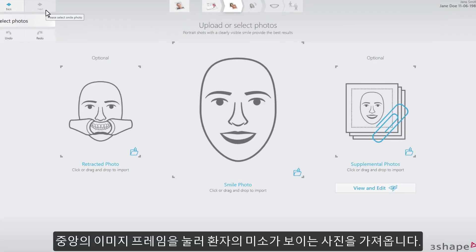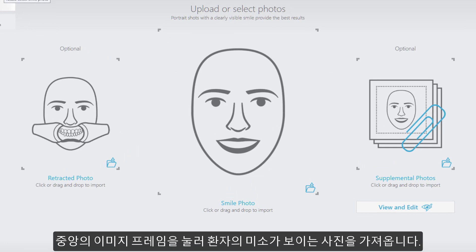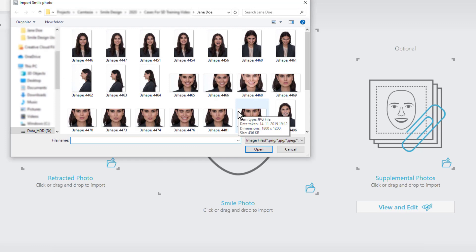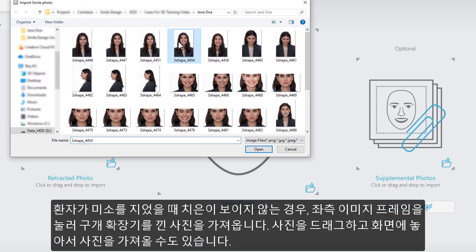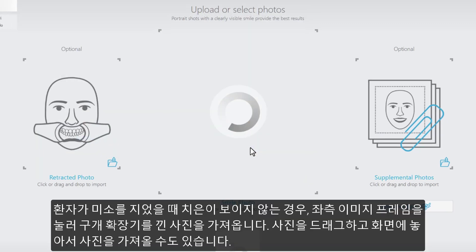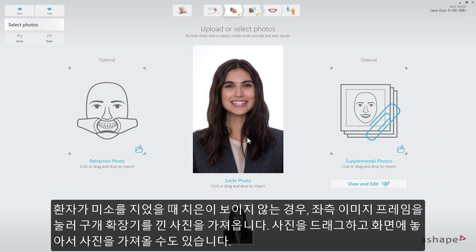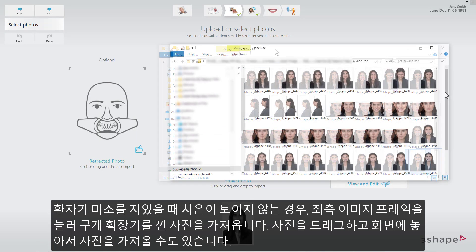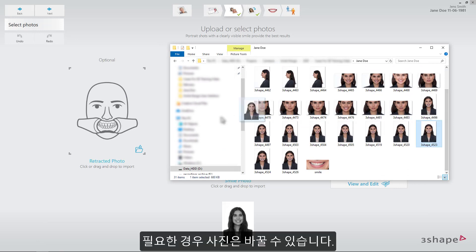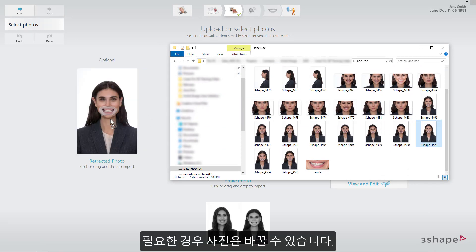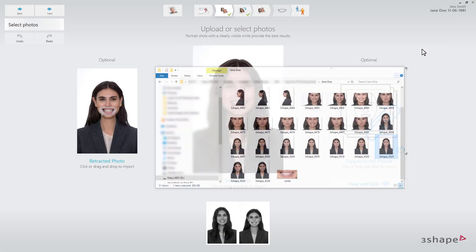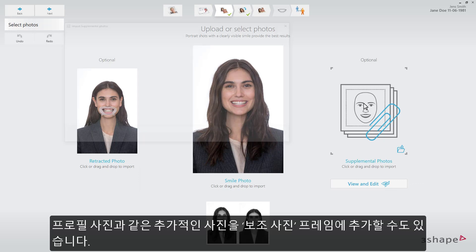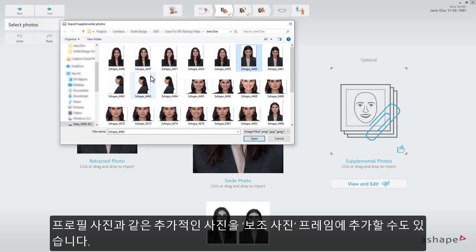Import a portrait photo of the patient with a visible smile by pressing the central image frame. If the patient does not show gum when smiling, import a retracted photo by pressing the left image frame or by dragging and dropping the image. These pictures can be switched if needed. You may add additional photos, such as a profile image, by importing them into Supplemental Photos.